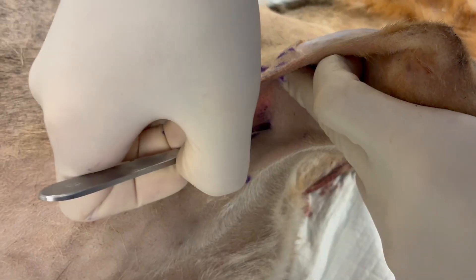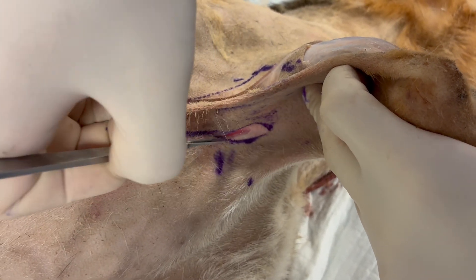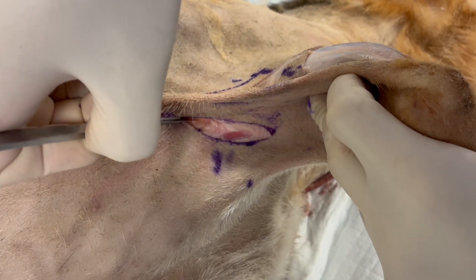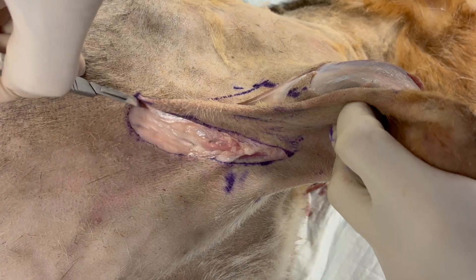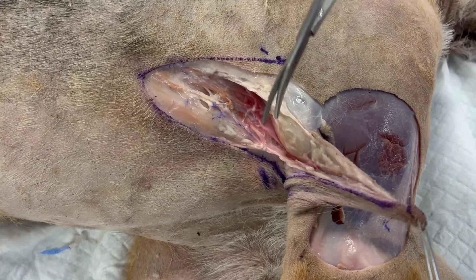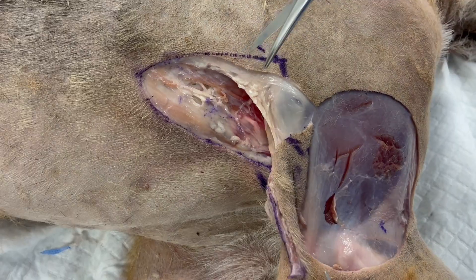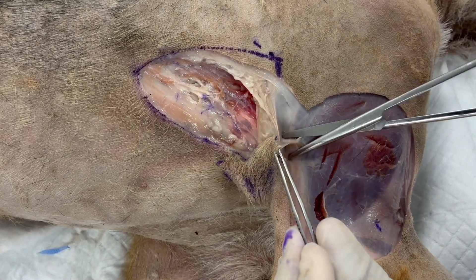The skin and subcutaneous tissues are incised. It is important to keep as much of the subcutaneous tissues and paniculus muscle with the skin flap. Here we are transecting the cutaneous trunchi, part of which is going to stay with the flap.